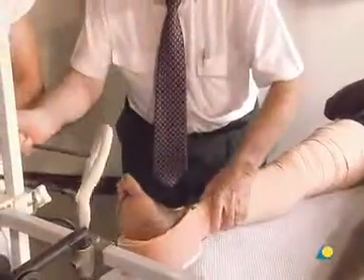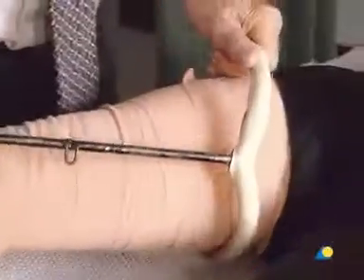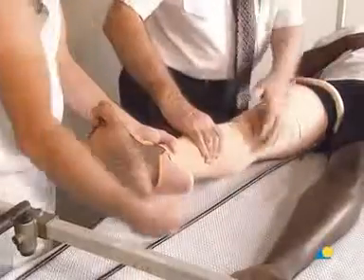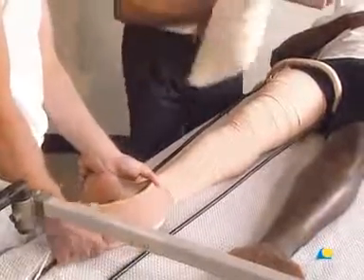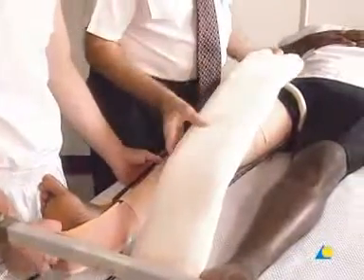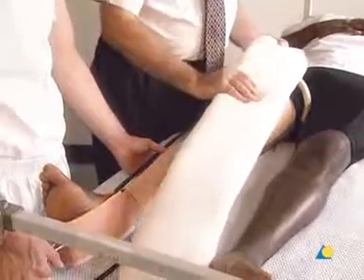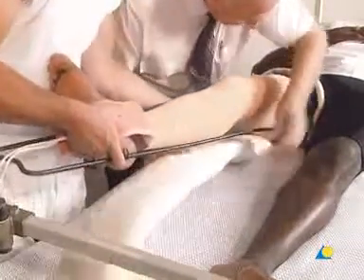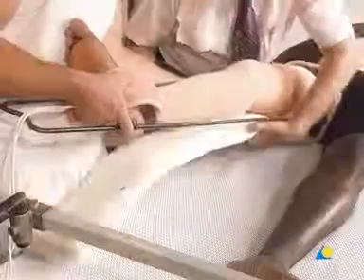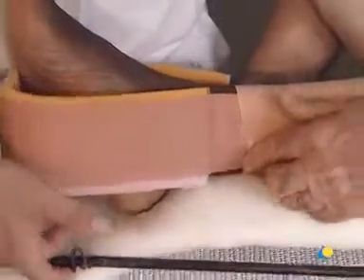The Thomas splint is applied by passing it over the patient's leg upwards to the groin. The cromer wire, which must be very well padded in order to prevent pressure sores, is placed under the patient's leg. Proximally, it extends to the ring of the splint. The cromer wire is bent slightly under the patient's knee and must be further bent to the angle of the heel in order to prevent pressure sores under the heel.